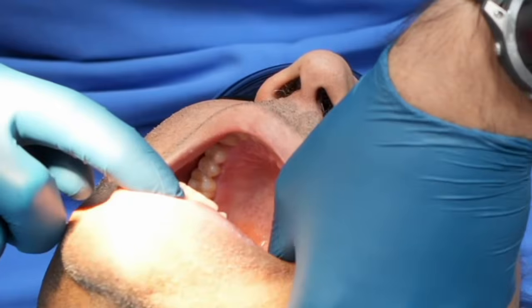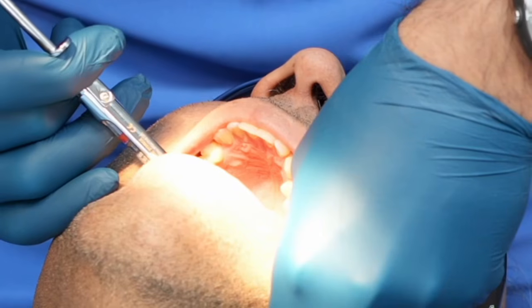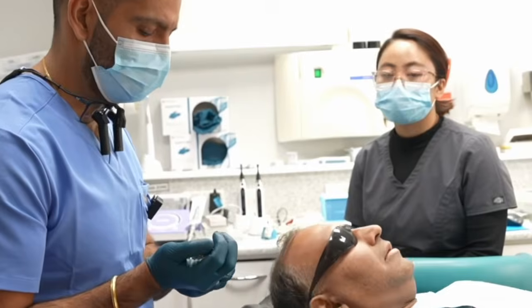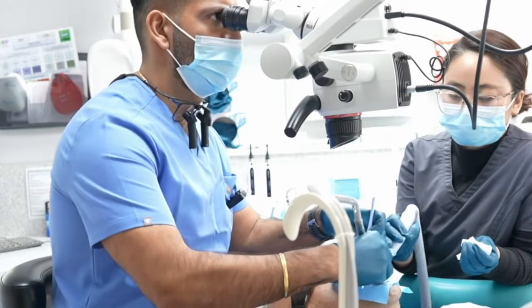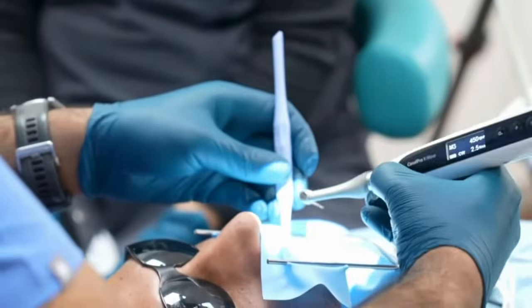The case that we've selected today for you is a lower left 6 that had deep distal caries. Prior to this visit today, the patient had a restorability assessment due to the deep distal caries, whereby we did a pre-endo build-up. The tooth did require DME, and we've done the DME with a composite resin restoration, and the pulp chamber was subsequently dressed with a calcium hydroxide dressing and a temporary filling over the top.